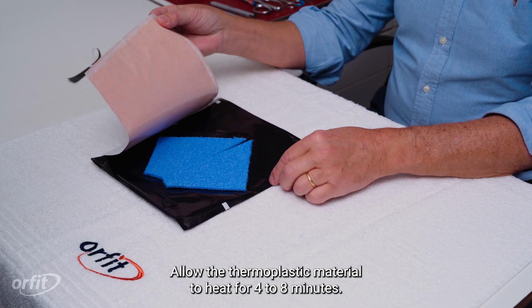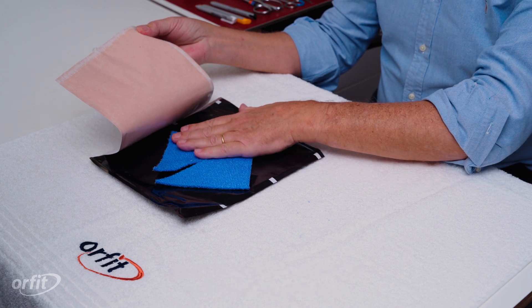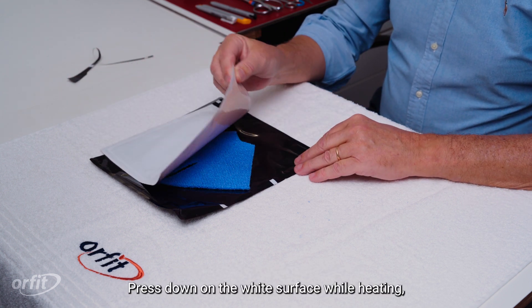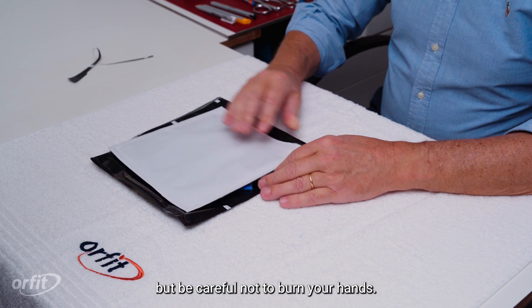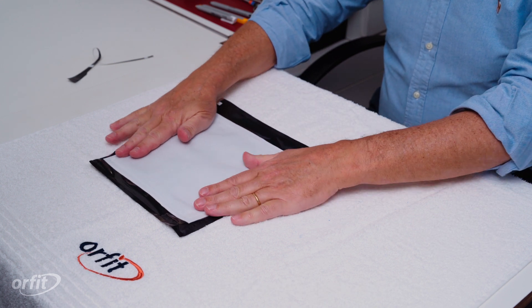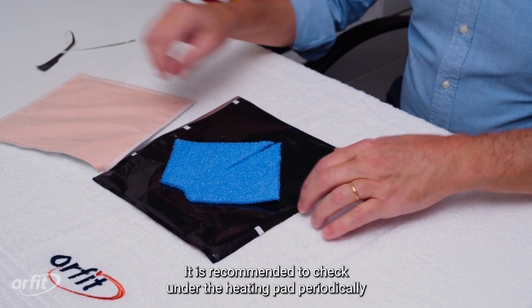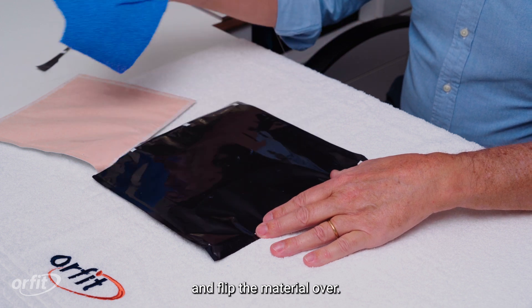Allow the thermoplastic material to heat for four to eight minutes. Press down on the white surface while heating, but be careful not to burn your hands. It is recommended to check under the heating pad periodically and flip the material over.